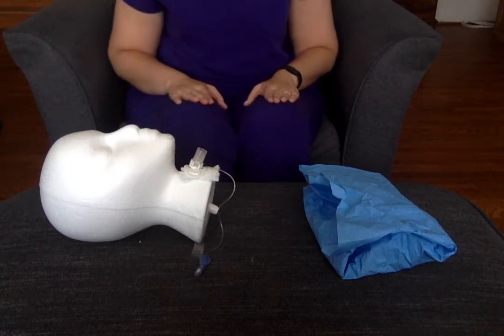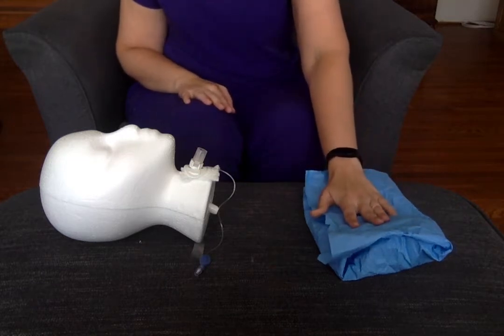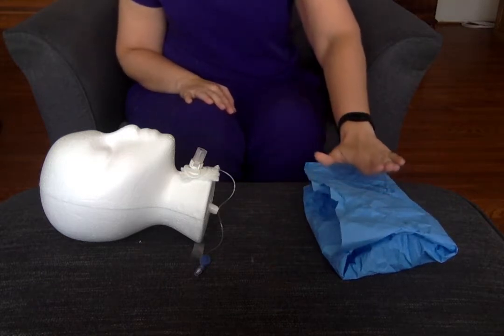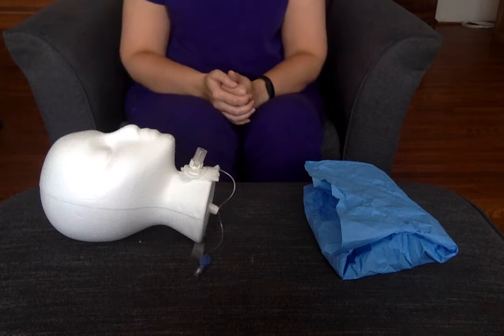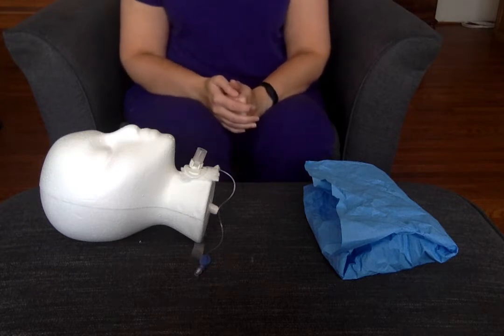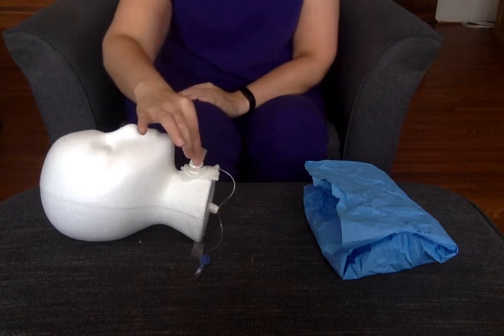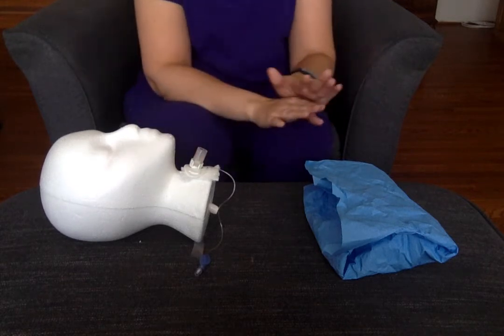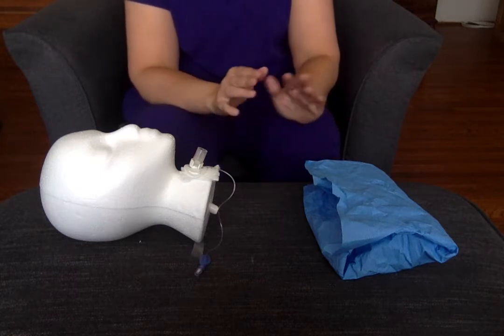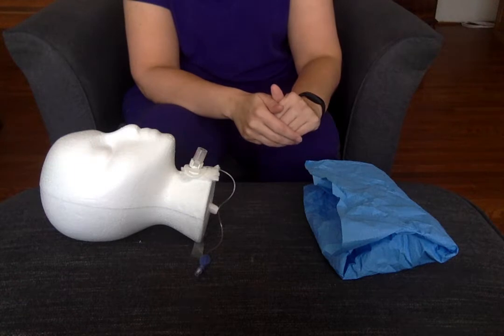And then we'll go into dressing change. I have my kit together. This one looks similar to your kit, but I've kind of piecemealed the items together, so it won't look quite like yours, but pretty close. We just finished suctioning our tracheostomy tube and we need to go ahead and change out this inner cannula. I have everything ready and my patient's verbalized consent — he understands the procedure and the rationales.